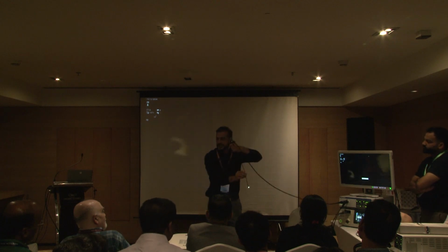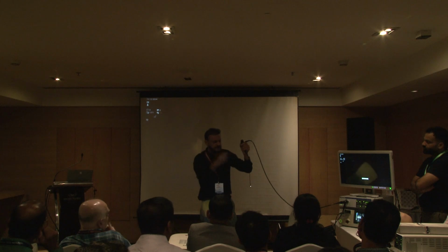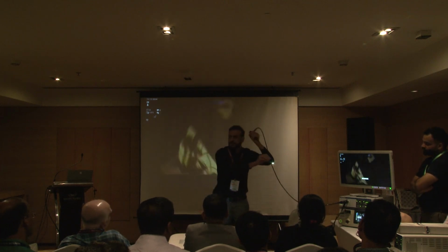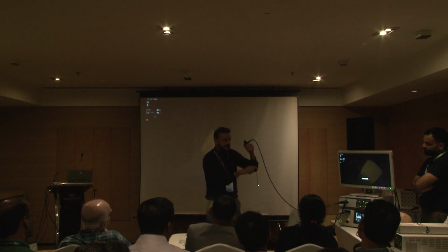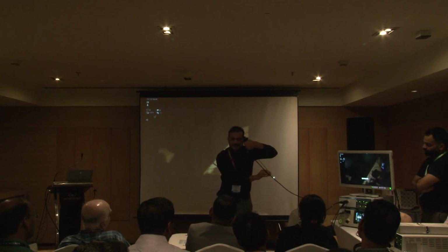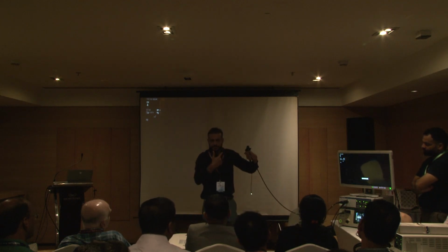Elbow movement also is there, and with this elbow you see how much he is doing it. This elbow movement gives them the entire range of movement to be seen. So you should try this movement also if you want to see. Normally when we see, the cord will be anterior, but try to rotate it and make it entirely in this manner. This will give you a picture of the entire anterior part and posterior part, completely reversing.